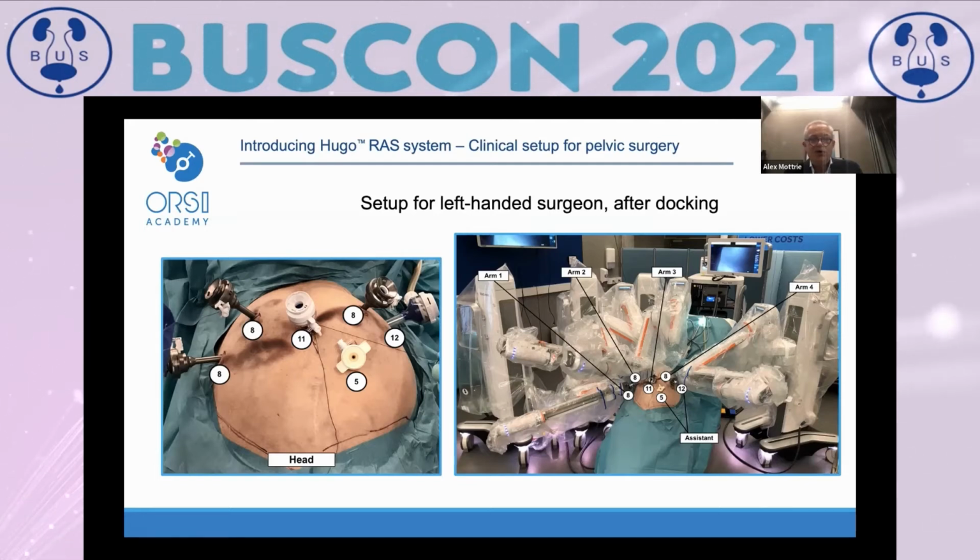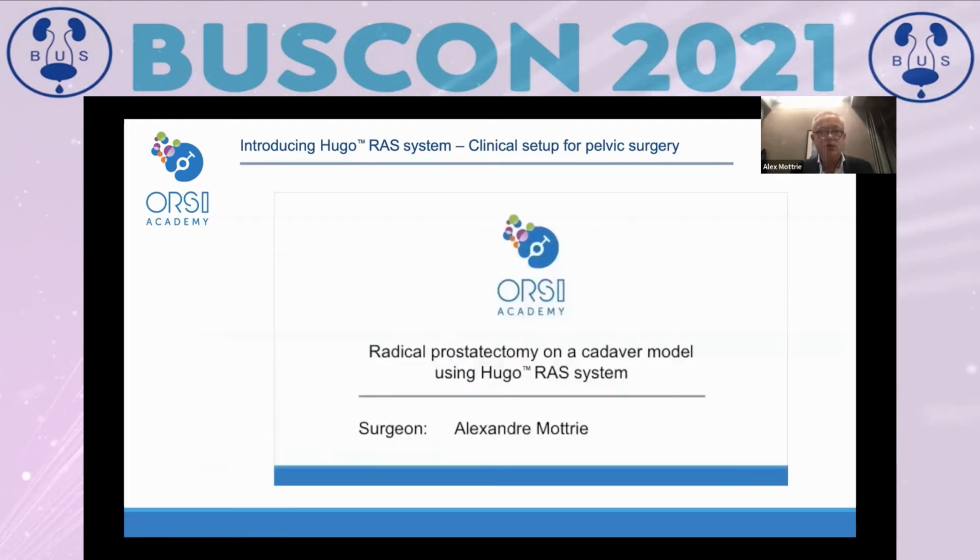I prefer, if possible, not to have lithotomy position because of the risk of compartment syndrome when patients are positioned too long on the leg holders. But again, this can be chosen, and this is also one of the good things about this robot, that we can use different options according to preferences without any problem.